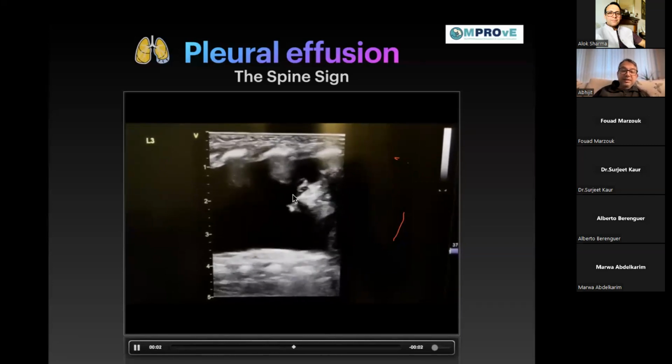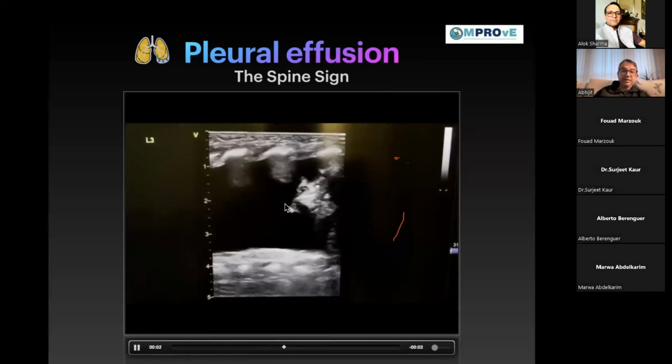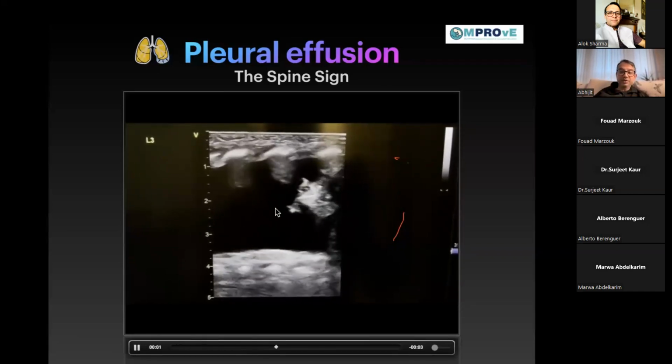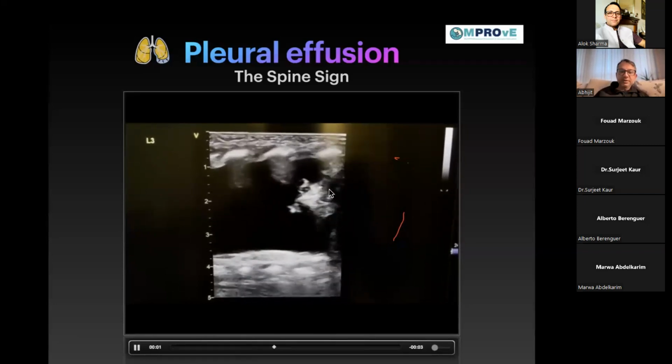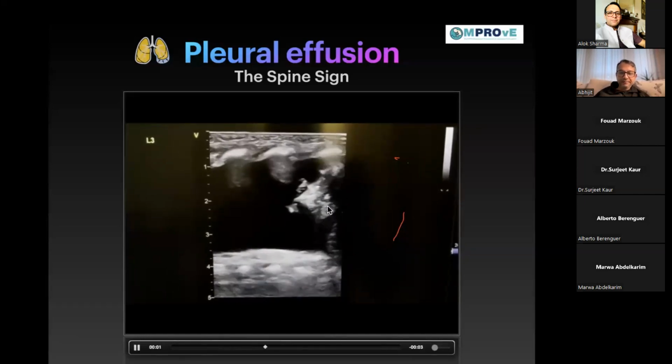So if something has to fill an empty space, the fluid has filled in the space. That's why you're getting pleural effusion there. And it will stay until the lung grows and pushes the fluid out. And this particular area you're seeing is the Gore-Tex patch, for the large type C defect repair. Anyway.